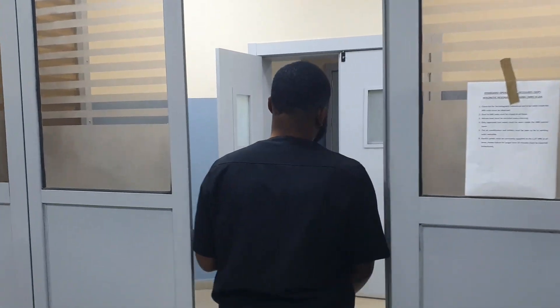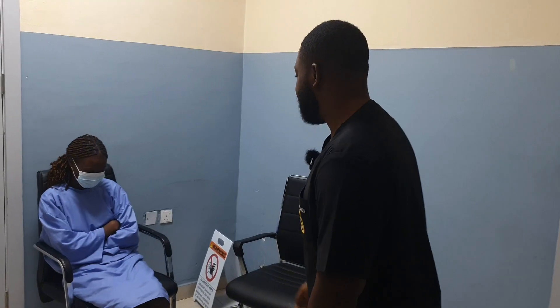So let's go to the patient and prepare the patient for the examination. I have here my colleague, so she's going to be my patient for today.